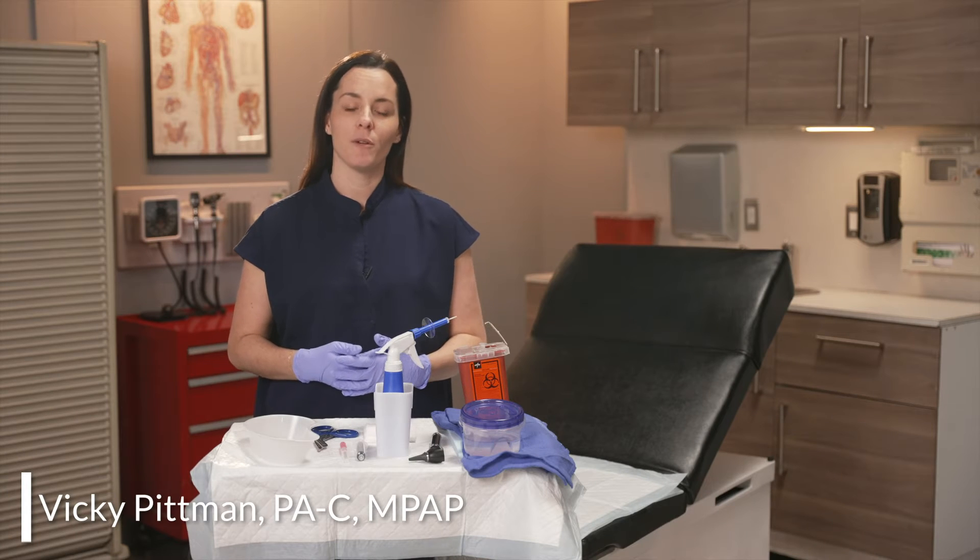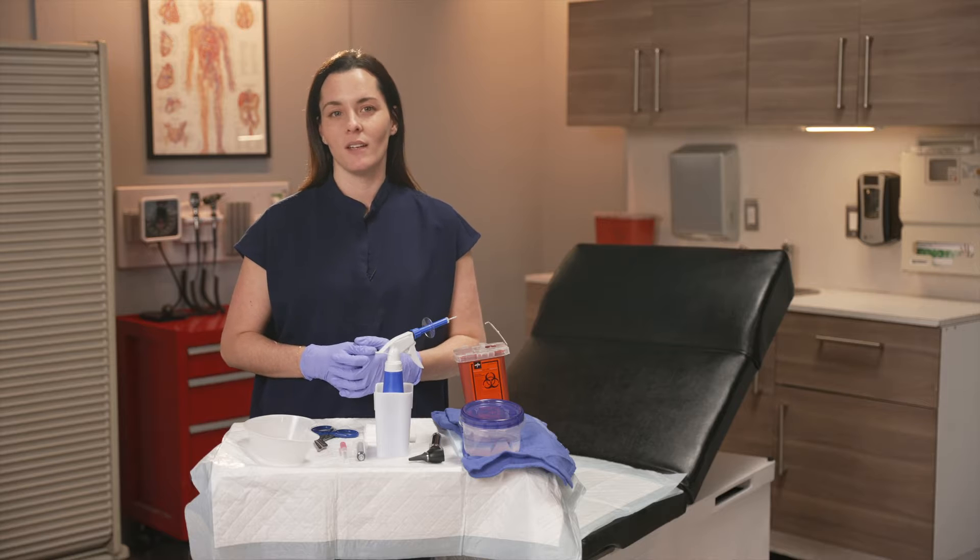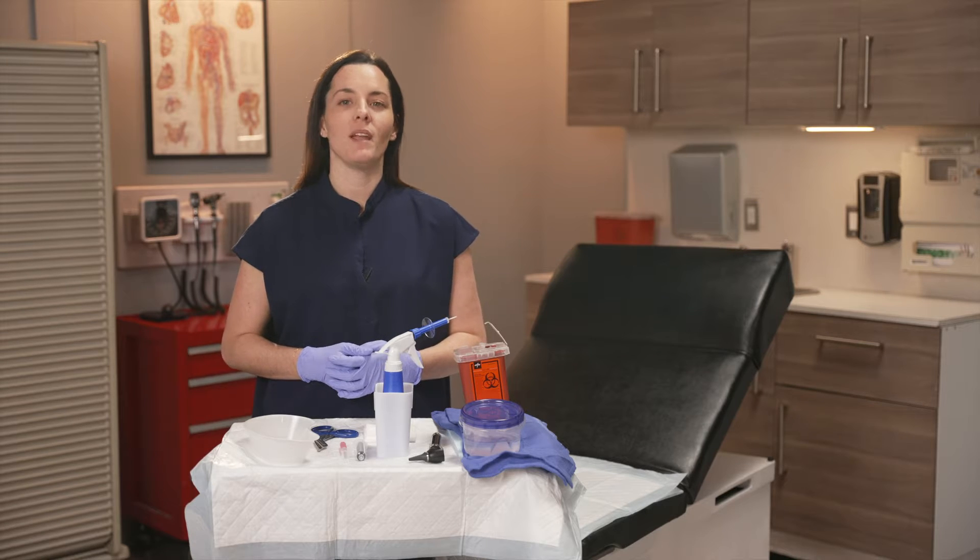Ear irrigation is a common procedure we perform on patients of all ages in order to clear a cerumen impaction. Let's review the procedure and equipment involved.